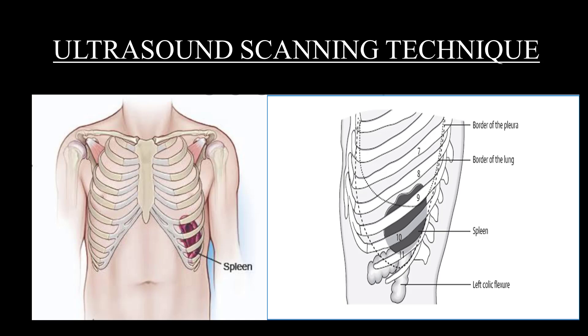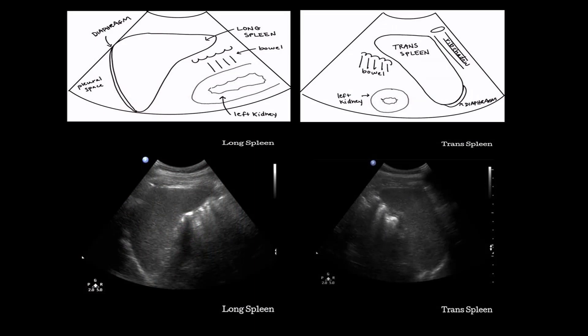In some patients with narrow intercostal spaces, intercostal scanning can be difficult. A transverse plane from a lateral intercostal approach may help to localize a lesion anteriorly or posteriorly within the spleen. While scanning, it's important to note the adjacent structures. On the longitudinal scan, the diaphragm is represented by the echogenic line, along with the pleural space, a part of the bowel loop, and part of the left kidney.